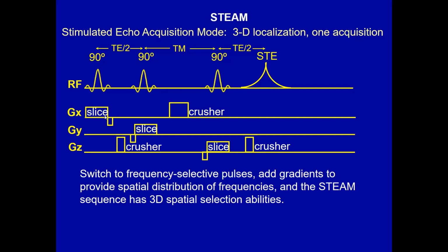So once it's tipped into the XY plane, that coherent magnetization sees tremendous inhomogeneity across the sample due to continuation of the slice selection gradient. It dephases the magnetization. So we apply the refocusing lobe. Here we have a refocusing lobe, and note that here we've put it before the slice, and here before the slice. That you can do that.